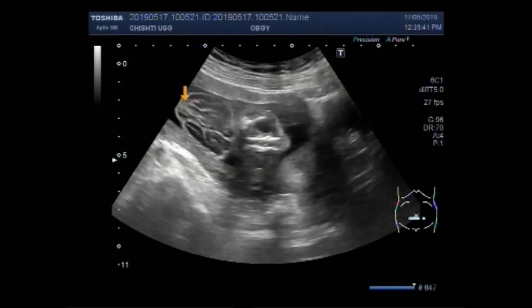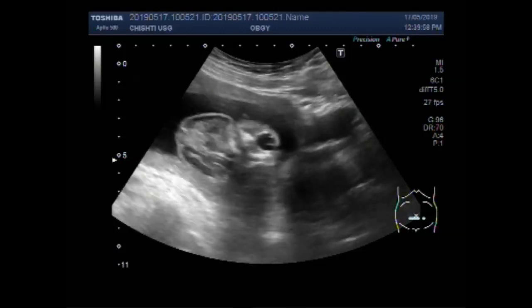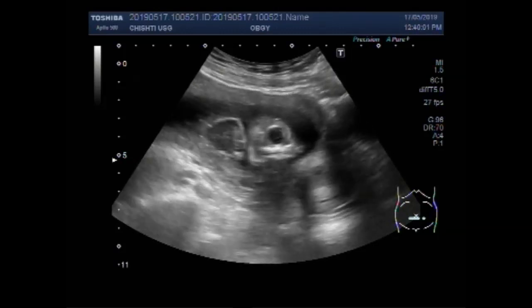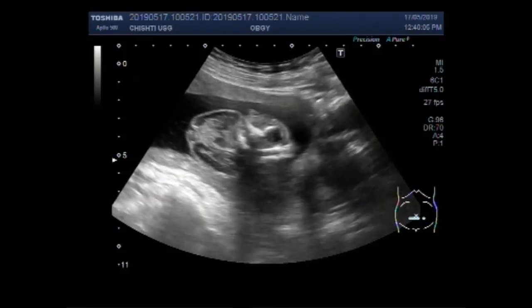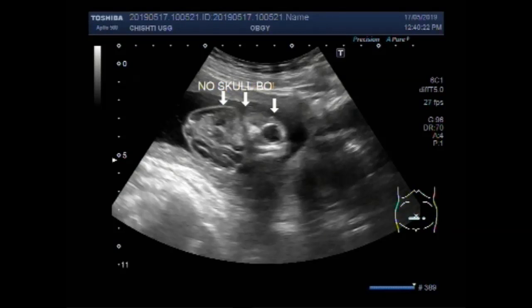Now this is the brain matter. It is very clear that it is uncovered by the skull bone. The skull bone is missing — no skull bone.